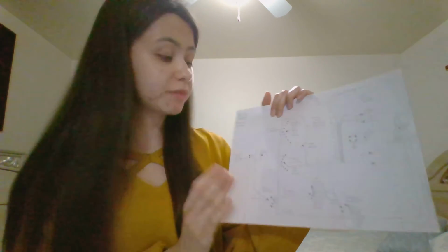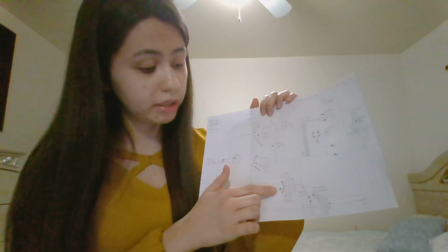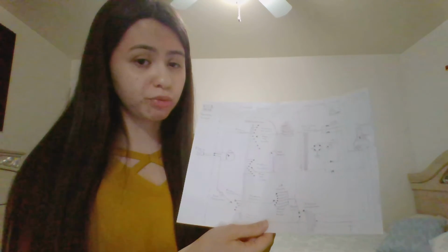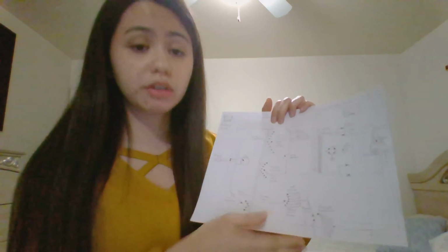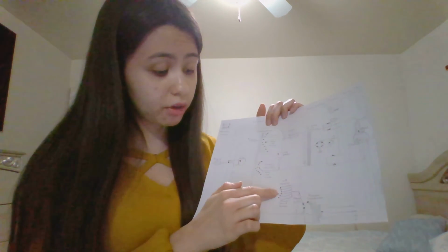All right, so if you go back down to the beginning, we're going to look at the filament side of the X-ray circuitry. So the filament side is going to go through the auto transformer again. It's going to come out through the secondary connections, and then it's going to go to the mA selector. And the mA selector is what we control because we get to choose what mA station we want it to be at. So say you want it to be at 300, 400, or 500 mA, you're going to choose whichever mA station you want, and then it's going to go on through.